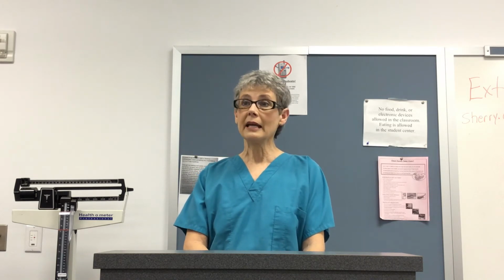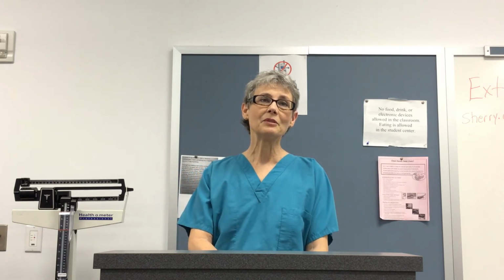If there's not a central catheter in place already, then that's going to be harder for the doctor, who would have to insert something and try to aspirate the air out. So it would be much better to prevent the risk of air embolisms than to have to deal with one.